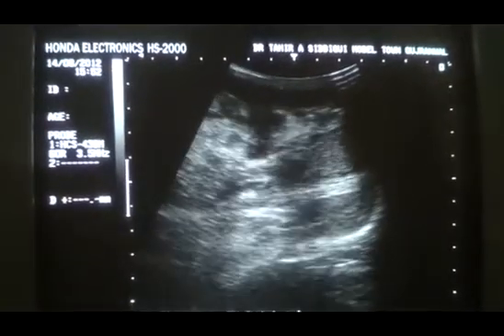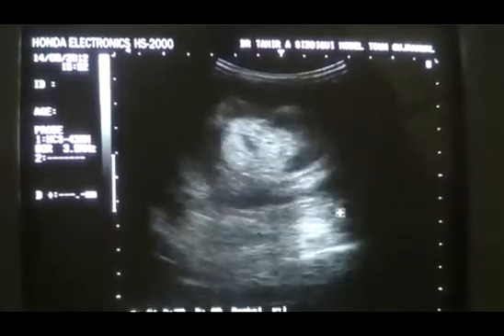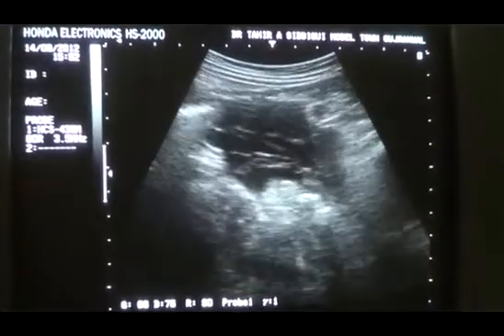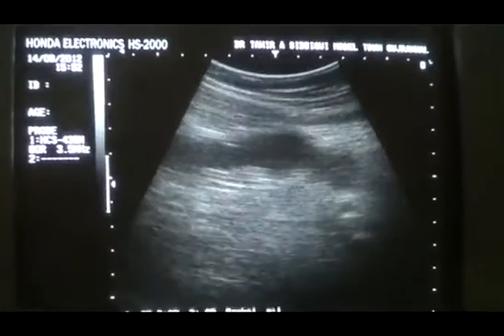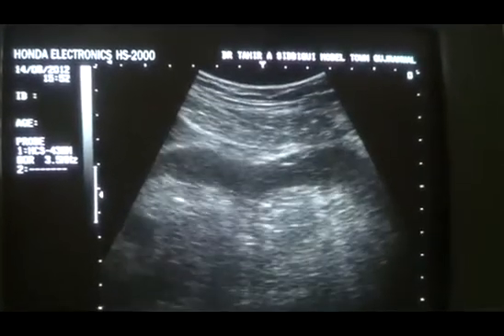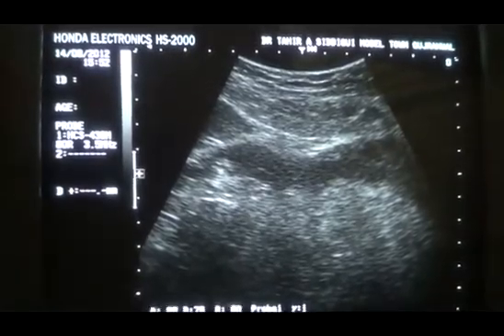So the conclusion is that this patient is toxic because of all the findings that I have. The collection, number one, in the lower abdomen, extending into the left hemiscrotum along with bowels. And the fluid contains septa along with debris. This is the fluid in the right lower abdominal quadrant, making a tract posterior to the urinary bladder and going up to the left paracolic gutter, where it is seen only 30 millimeters deep from the skin, and this fluid is filled with echoes. So this is a case of multiple post-operative pathologies. Thank you.